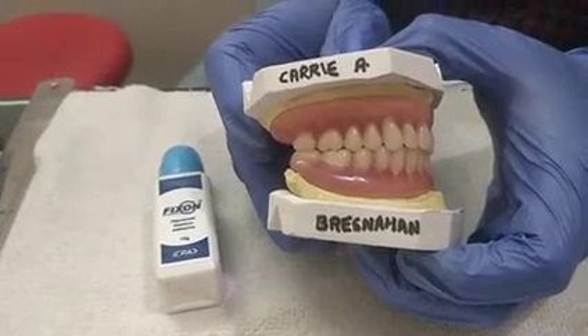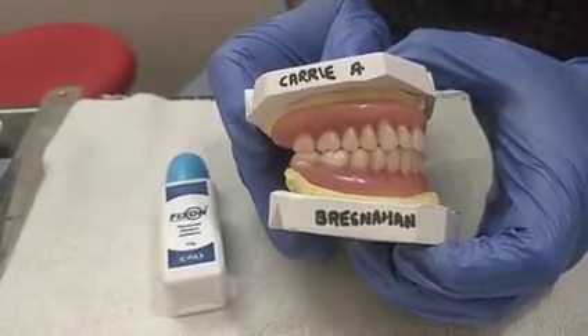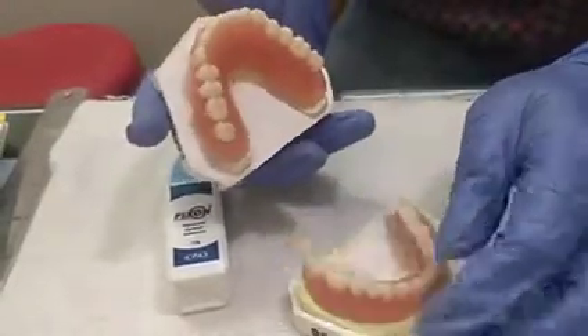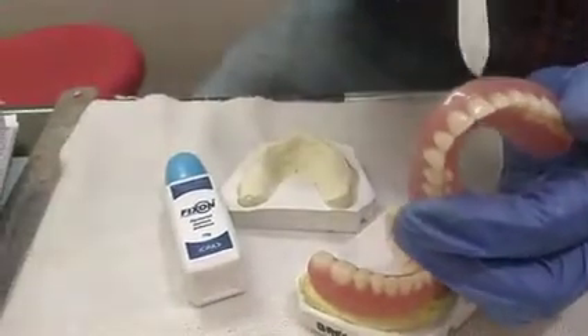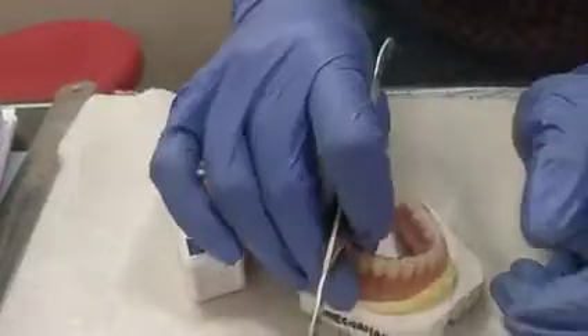Today I have made a complete upper and lower acrylic denture for my patient. This is the upper acrylic denture with the root carving. You can check the root carving on all the sides, and similarly there is a root carving on the lower.